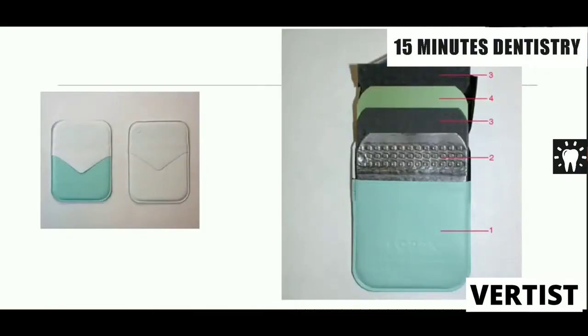And if you're going to write about the X-ray packet when I'm asking about the X-ray film, you'll get 0. So be careful, read your paper properly. If it's X-ray film, then you talk about the plastic base, the gelatin and the silver crystals, the silver halide crystals.